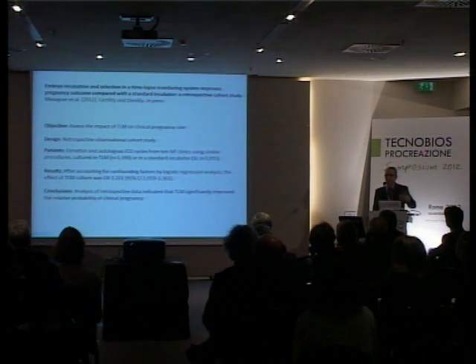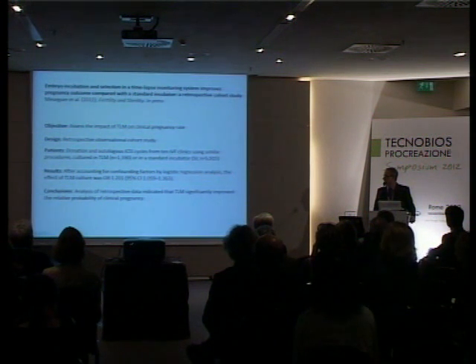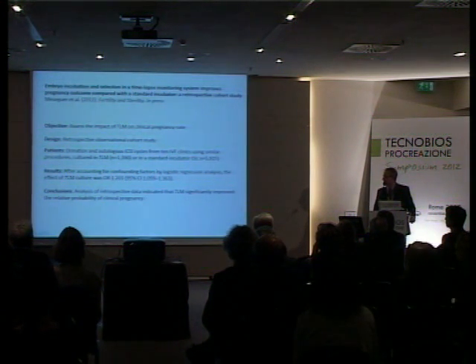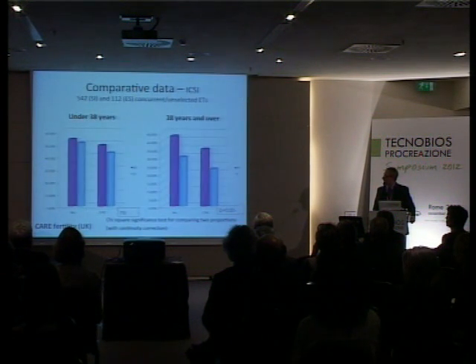So this is a suggestion that the system may be beneficial, but per se the study is retrospective and cannot be considered conclusive.